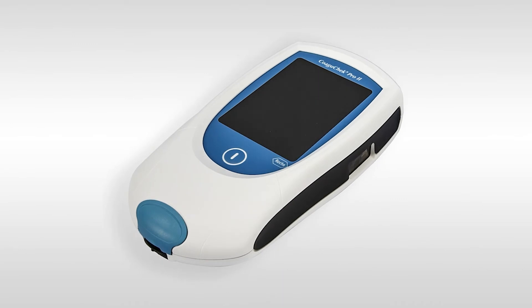Looking at the front of the meter you have the power button — please press this to turn the meter on and off. The meter has a touch screen; please don't use sharp objects.